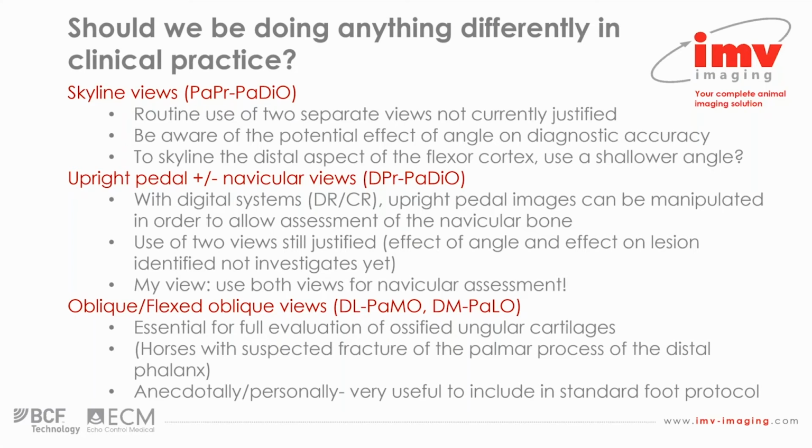And my personal view is that I find them very useful to include in a standard foot protocol. However, that is my personal view, and based upon this study, we can't necessarily say that they're of any additional diagnostic benefit to include as a standard view. But I would love to know what you think on the matter.